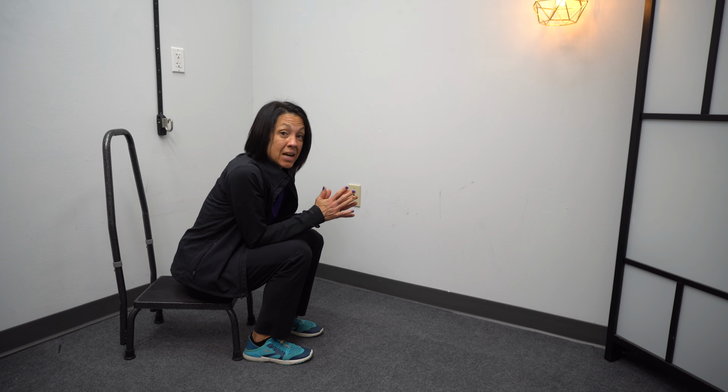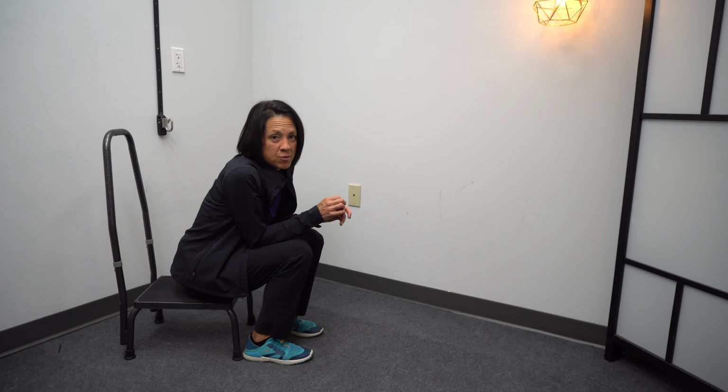And the reason I think this is such a valuable tool is because it addresses an exercise that I love that I think most people with spasticity neglect, either because you think you can't get into this position or it's just too challenging to get into this position. But it is probably one of the most valuable stretches that you can do on your own to address that foot spasticity, and it really just comes down to physics.